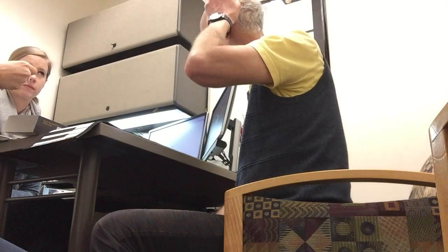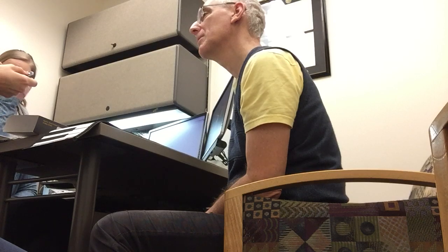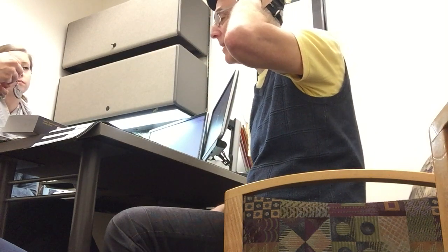Actually, I'm planning to get a haircut, so there'll be even less hair than there is now. So it'll stick a little better probably. I would say be careful until next week. Obviously, this is something you haven't had to wear before, so I'd just be a little more cautious. How does it work with a hat? That can be a little challenging as well. I mean, that probably will be fine. It's going to cover it.